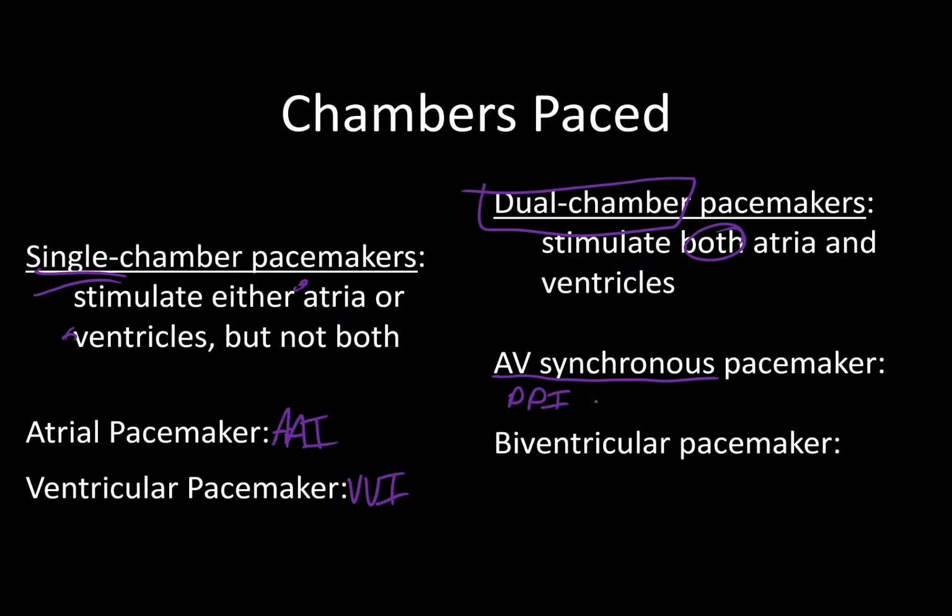But the idea is that you maintain cadence between the atria and the ventricles, so that the pacemaker is completely in control, and it says, I pace the atria now, and then after an appropriate amount of time, I pace the ventricle to, again, artificially create an appropriate heart rate, heart rhythm, things of that nature.